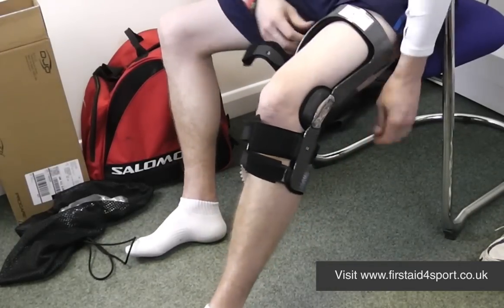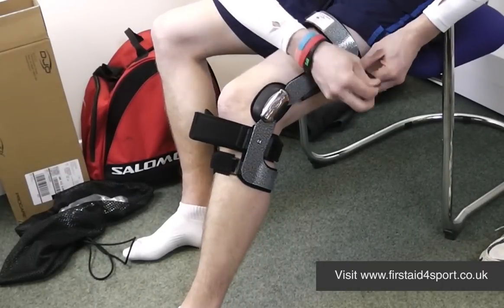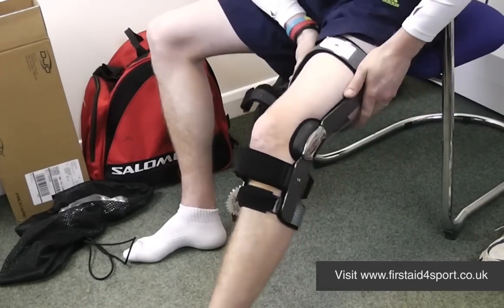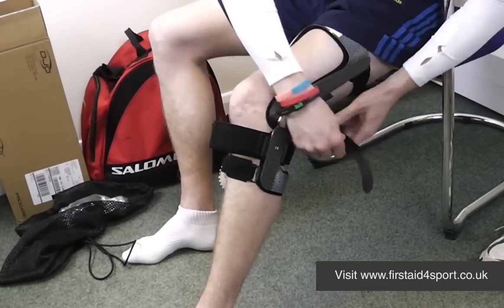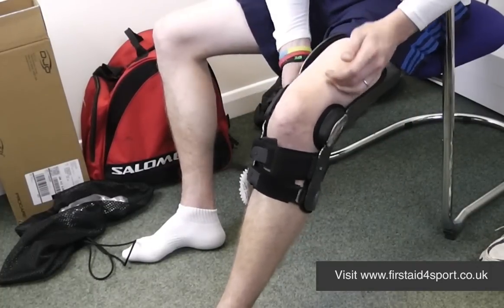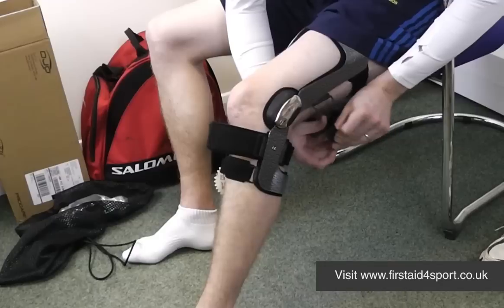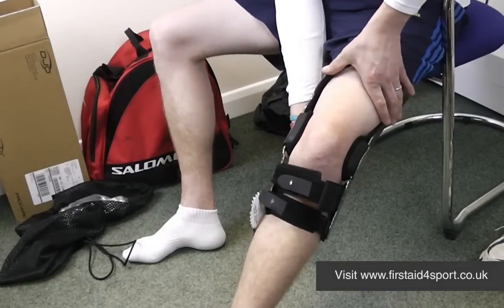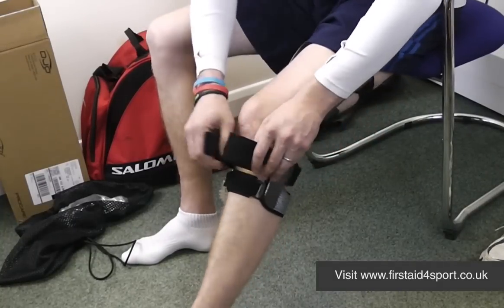Number two is at the top of the thigh — push the frame down and do it up. Check how it's feeling. Number three is at the back of the lower thigh. You may need to adjust it; it may well be that you have to cut the strap slightly, which is absolutely fine. Feed it through, and when you do number three up, you'll feel it pulling the hinges down, which is absolutely what it's meant to do.